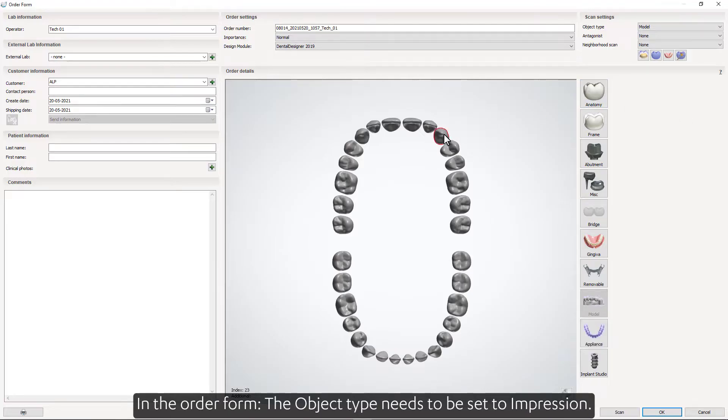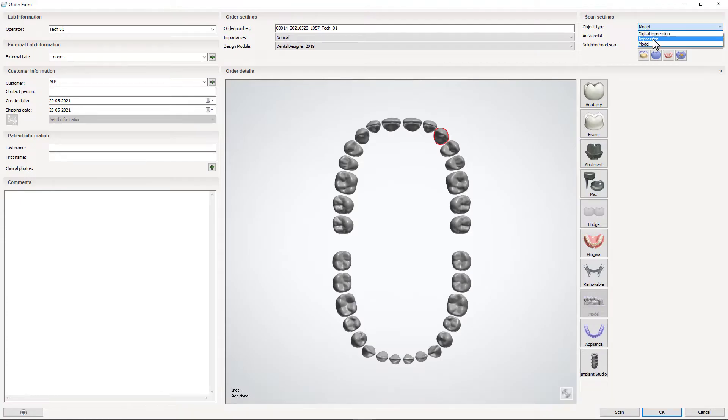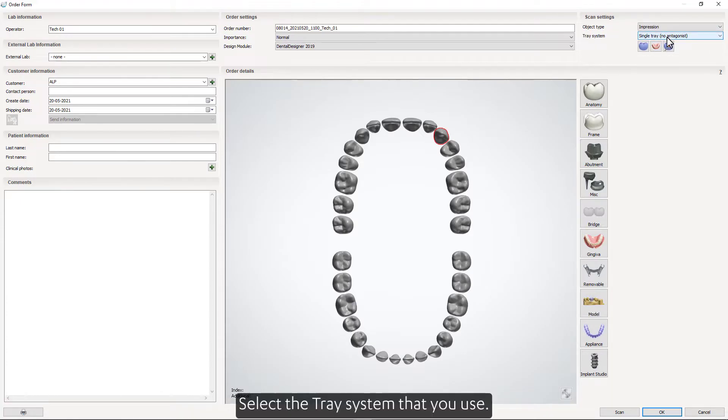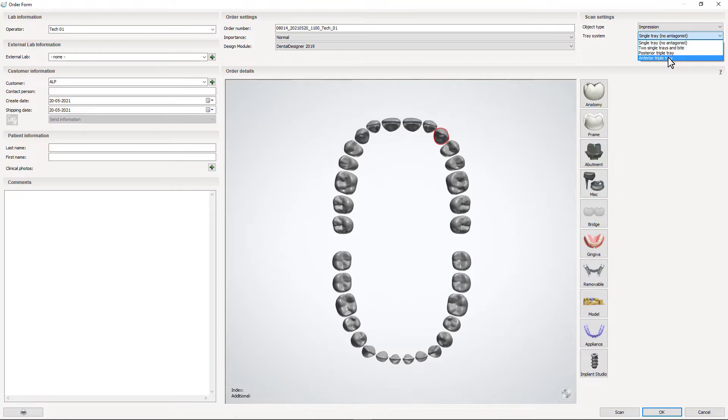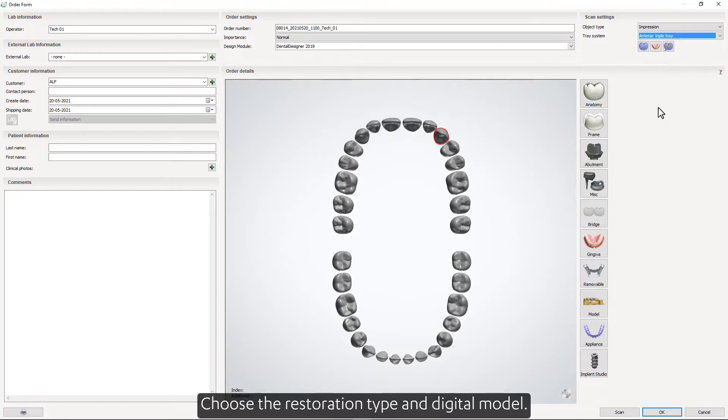In the order form, the object type needs to be set to Impression. Select the tray system that you use. Choose the restoration type and Digital Model.